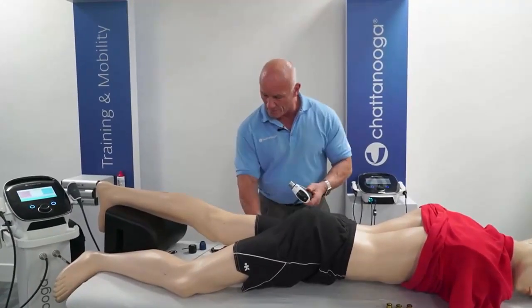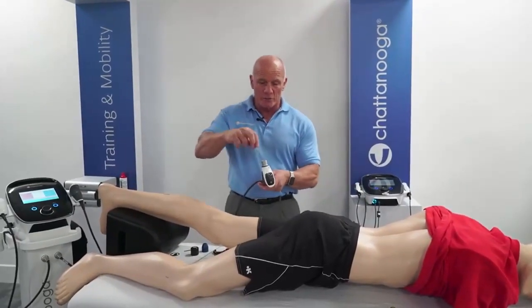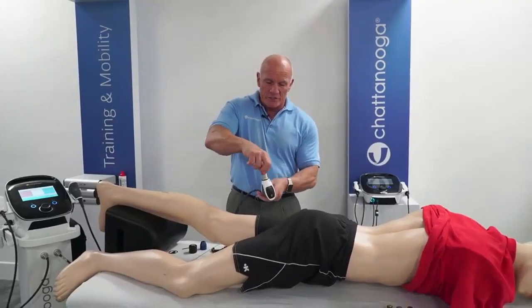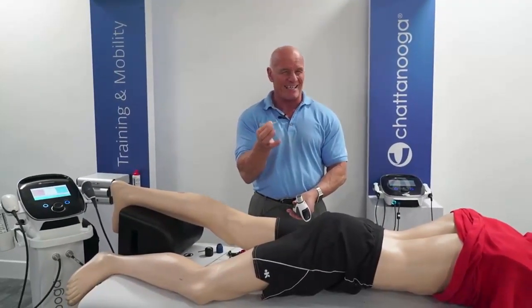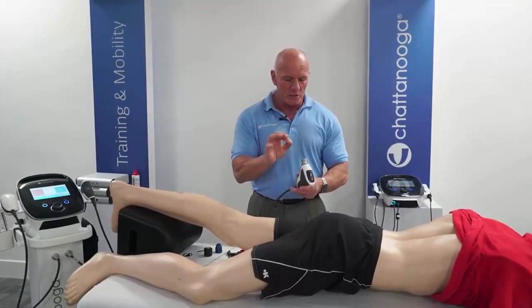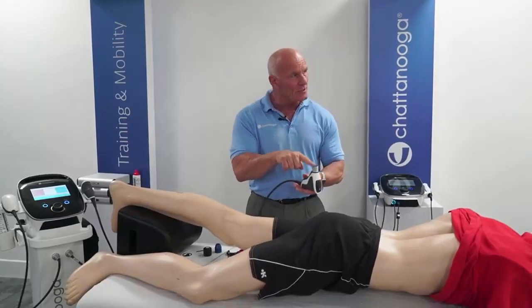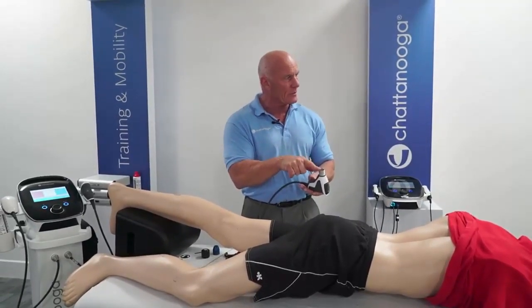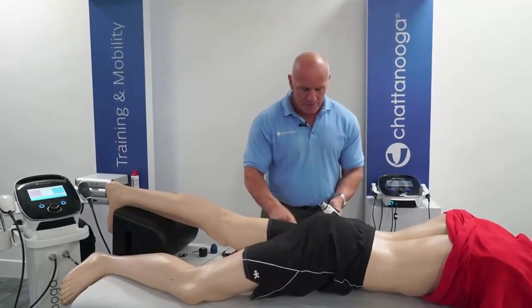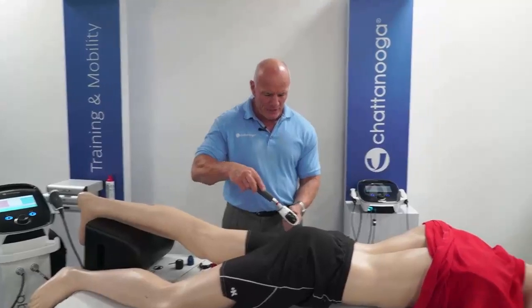Then get a cotton bud, or you can get a tissue and just wind it up and move it around in there. It comes out, trust me guys, it's going to be black, just because we've got all these little metal iron filings in there. If you allow those to build up, that's where you'll start to have issues with your handpiece. So take that daily little measure, and you won't have any problems at all.